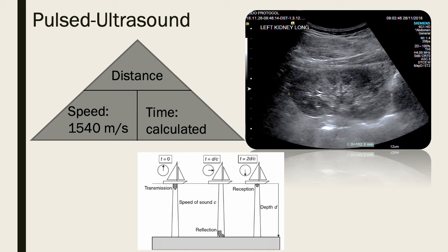What is incredible is just how quickly this happens. When you're actually scanning real time, there's very little lag. When you're scanning, it just seems like you're seeing everything all at the same time, when really these crystals and the machines are working so quickly to put together these frames for us.